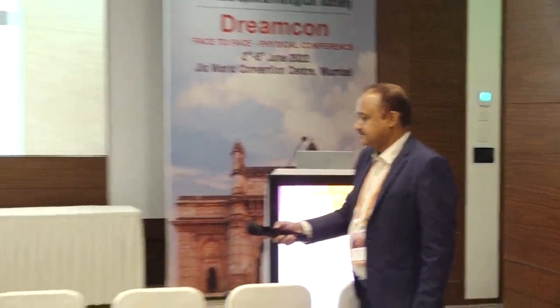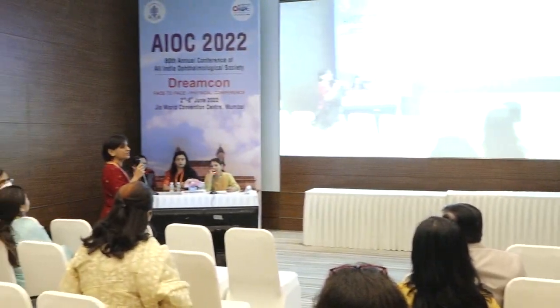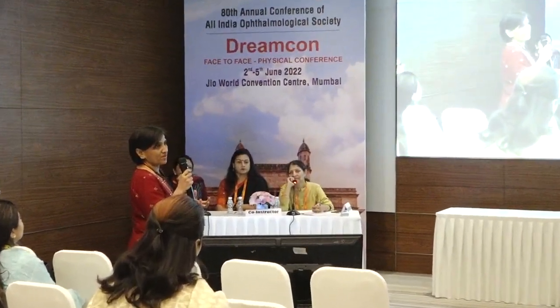She just answered. Actually, this is used as a screening tool, so you can always do gonioscopy and confirm. You do photopic and scotopic imaging to see how the iris is behaving, and after that you can just give knowledge to the patient. So the patient understands what his anatomical position of the eye is, and whenever there are symptoms, you make them aware of the symptoms. We are basically making the patient more aware.